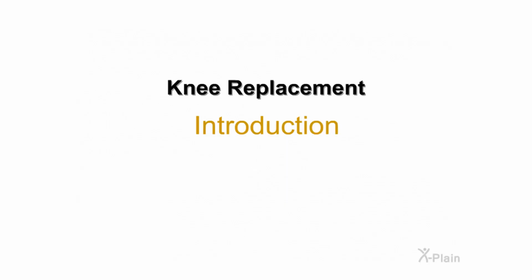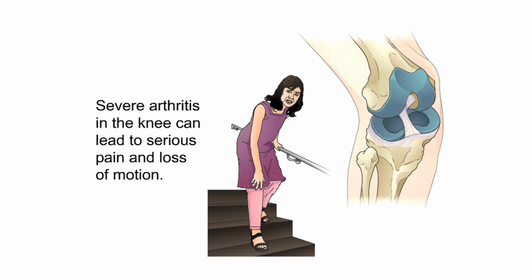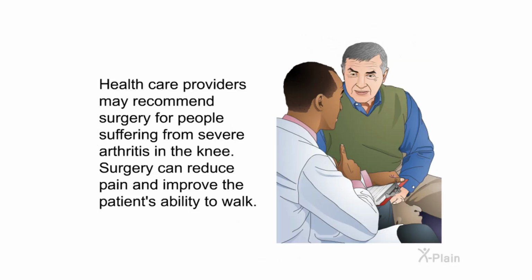Knee replacement. Introduction. Severe arthritis in the knee can lead to serious pain and loss of motion. Healthcare providers may recommend surgery for people suffering from severe arthritis in the knee. Surgery can reduce pain and improve the patient's ability to walk.